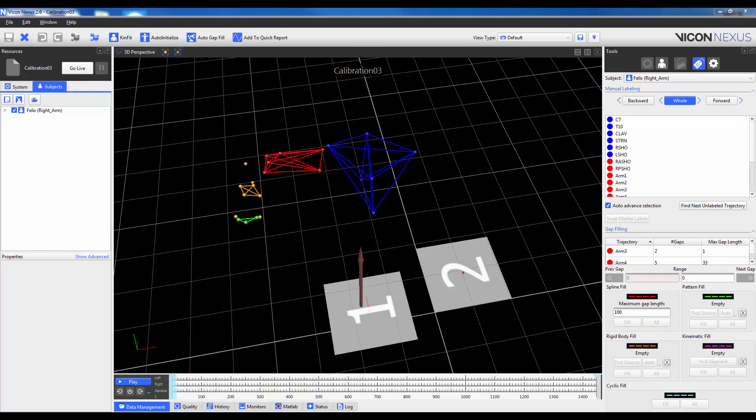To use ProCalc, you will need a valid Nexus 2 license, as well as labeled trials saved in the C3D format. In this trial, I've got a calibration range of motion trial for the right arm and thorax.